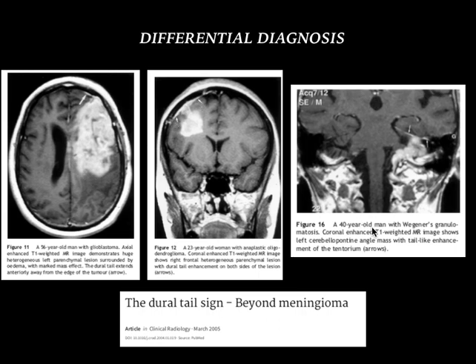This is a 40-year-old man with a known case of Wegener's granulomatosis. You can see a heterogeneously and intensely enhancing lesion in the left CP angle, and you can see the tentorium on the left side is thickened and showing enhancement — a case of Wegener's granulomatosis.